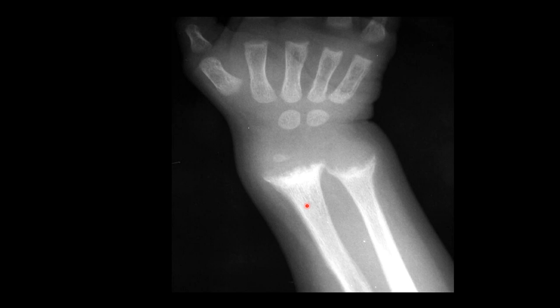Because the bones are weak, when there is weight bearing on the bones, they splay out — that is, there is splaying. And there is cupping; this concavity is the cupping. This flaring out is the splaying, and the irregular margins are the fraying.